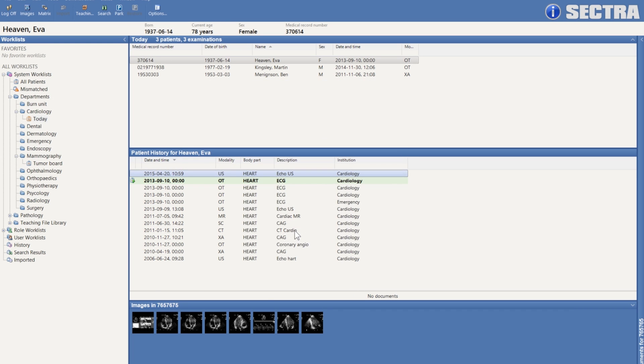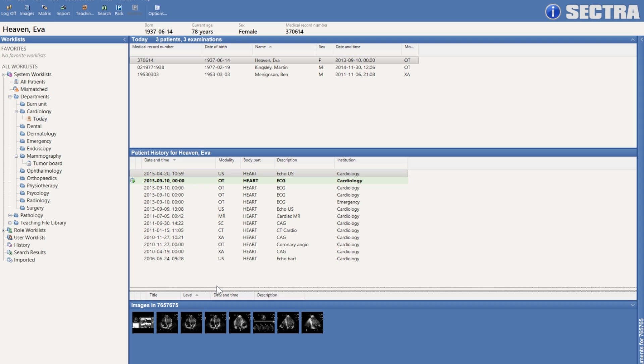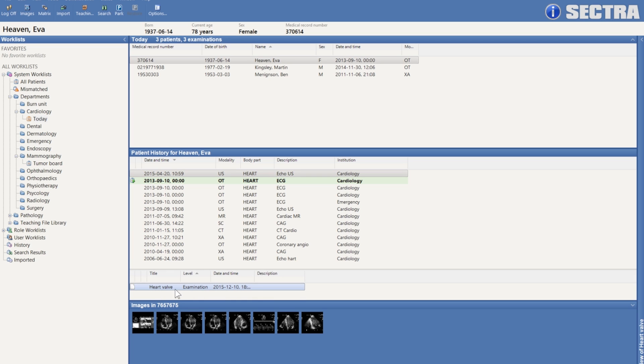I can save this file and now it will be stored in an XDS repository. If I had software on this machine that were able to open this CAD drawing, then I would be able to open it. Otherwise, I can simply save it back to the desktop. That way we can support true enterprise imaging, supporting cardiology and ingesting non-DICOM files of any format whatsoever.